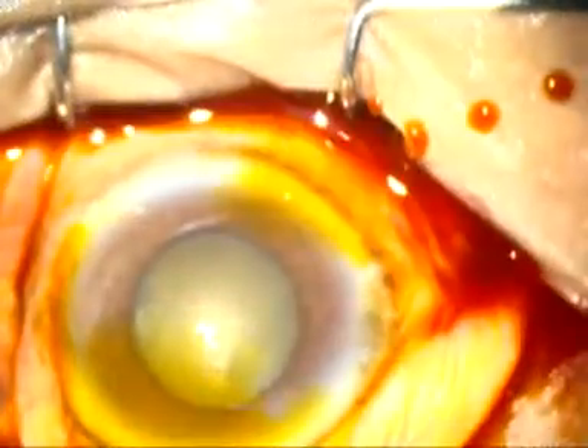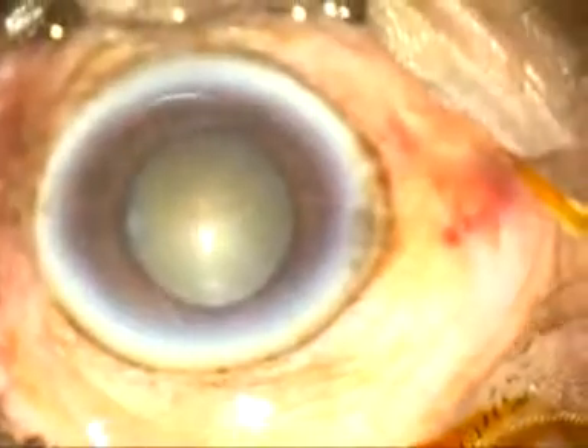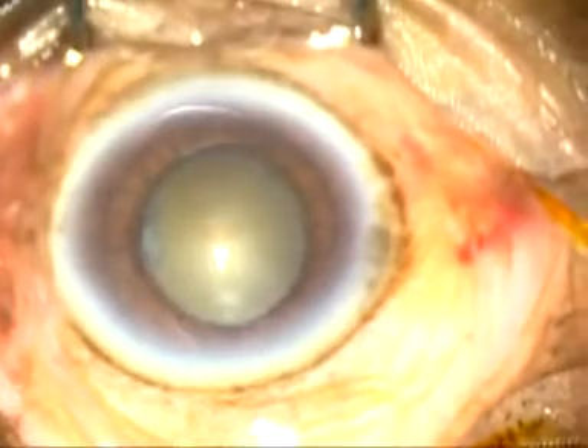Dear colleagues, this is FACO's evacuation of a cataract with grade 4 nuclear sclerosis and a 4.5 millimeter pupil. The ocular surface is thoroughly irrigated with Ringer's lactate, applying a few drops of povidone iodine. Povidone iodine has been applied in the preparation room for 3 minutes. Now we are going to start the case.